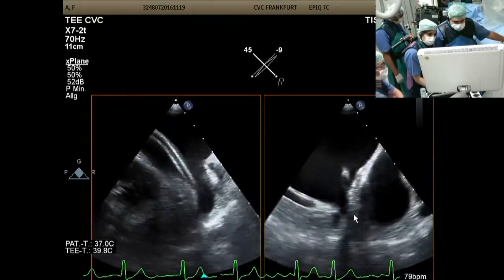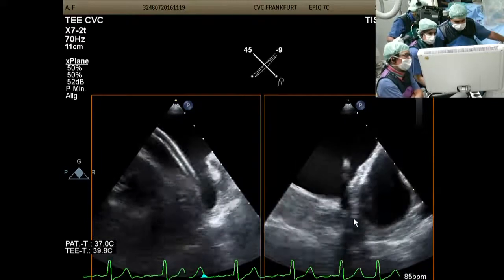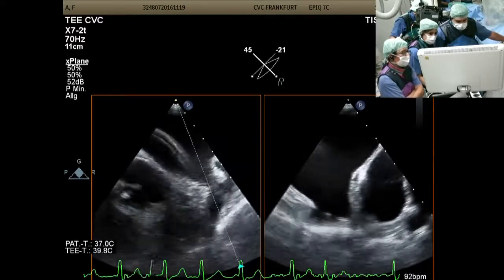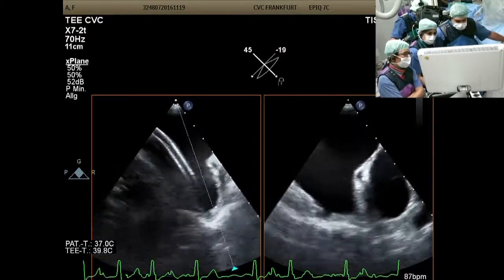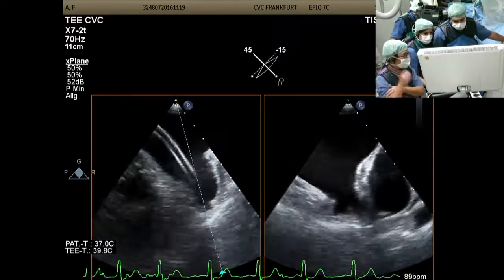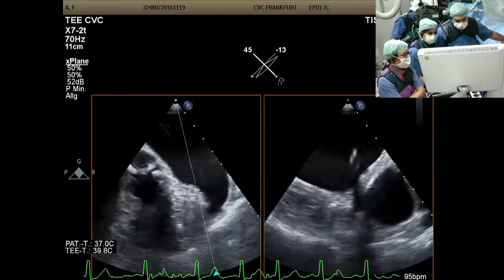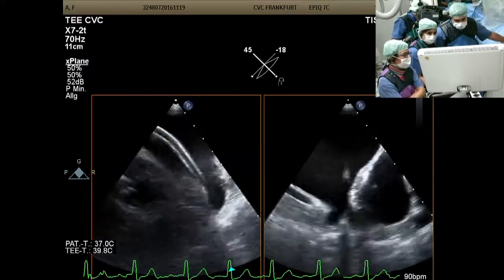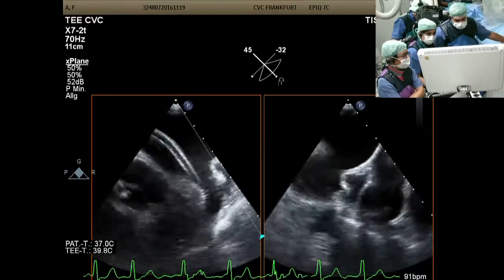Looking at the left panel, if ever you wanted a coaxial sheath, that's perfect. I think we'd all agree that looks good. But like we said earlier, if it's Amulet, maybe it doesn't matter, but I'm saying it just in terms of these appendages, you don't always need it coaxial. Sometimes you gain more depth by non-coaxiality. Agreed, and of course we have to advance the device, which may change the orientation of the sheath.